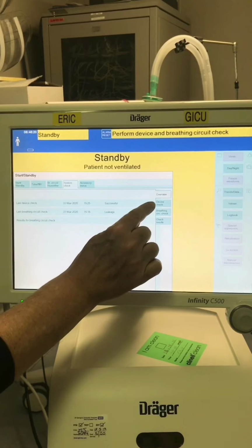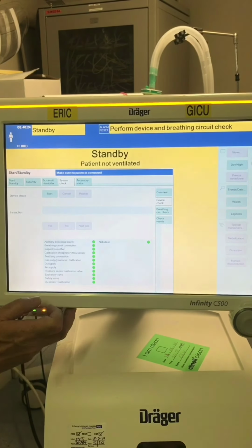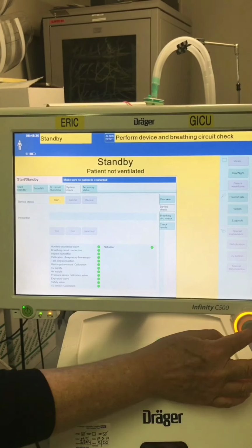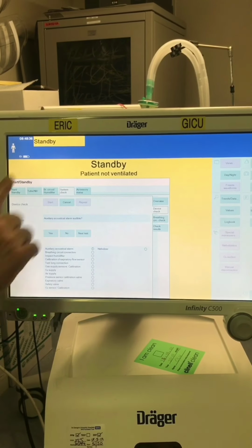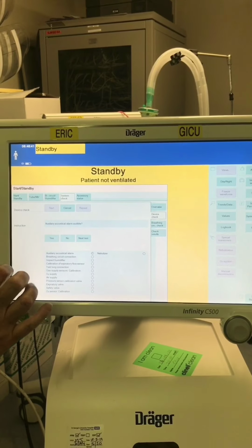Now I can see some tabs down the side. The first one says device check. If I press that, it takes me to the device check page, and I have a start button here, which I click on and confirm. And the device check will actually run through all of the parts. The operator just needs to follow the prompts on the screen and respond appropriately.